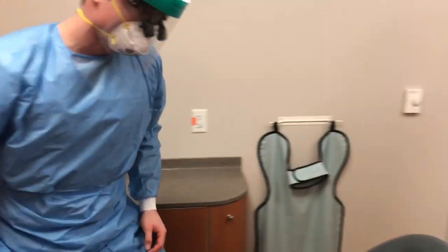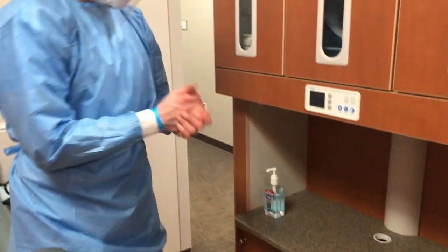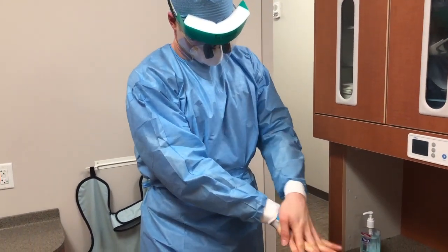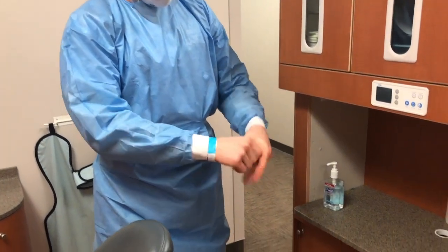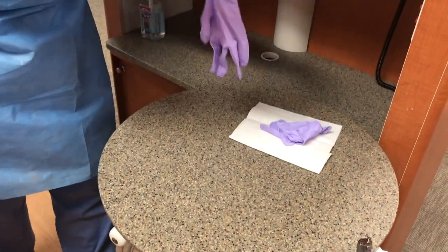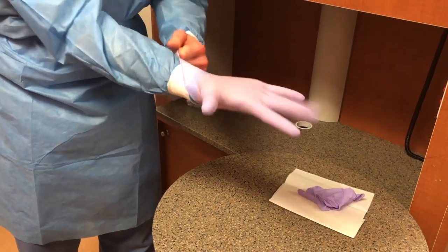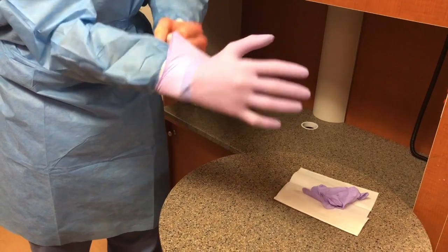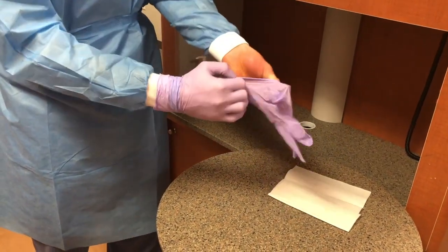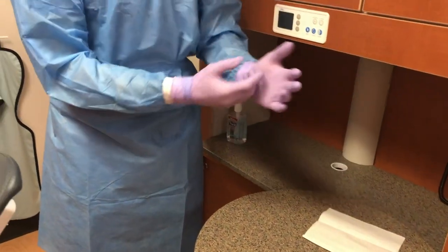Once you're ready to begin, perform hand hygiene one more time before donning your gloves. Alcohol-based hand sanitizer is acceptable for this purpose. Try to make sure that your gloves cover the wrist cuffs of your gown. You're now ready to begin treatment of the patient.